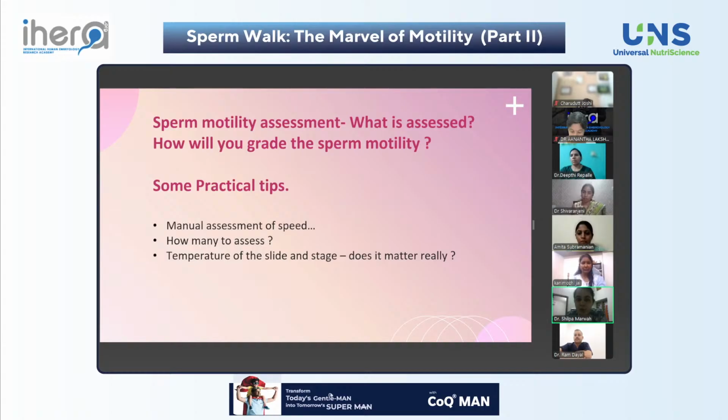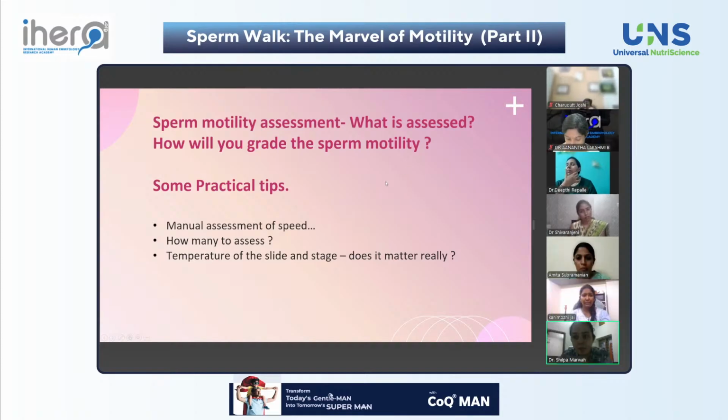And I just want to add one point. If any new beginner is doing the semen analysis, his or her report should always be cross-checked or rechecked by the senior one. This is how I think they learn doing semen analysis. And definitely motility is a critical parameter to analyze in a semen analysis. So they should be very fast while counting the motile sperm. They should not be slow, and definitely rechecking makes them better in their further semen analysis reporting.